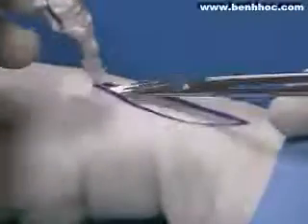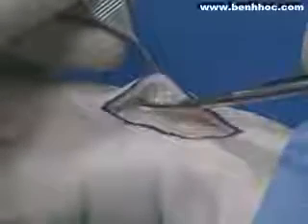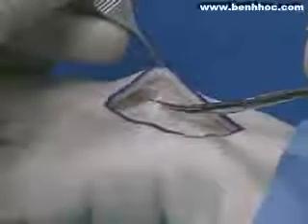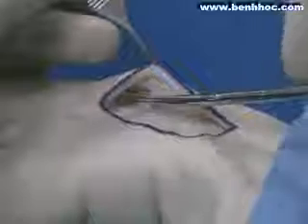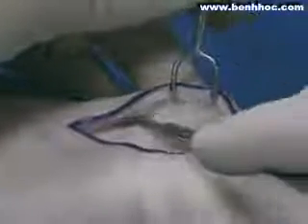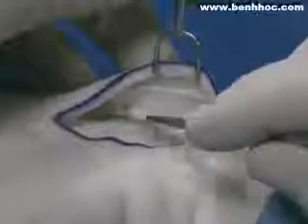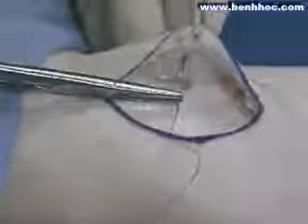The middle finger can also be used to aid in the retraction of the soft tissue during the dissection. In order to allow the tissues to come together during the closure, undermining is necessary. When scissor dissection is used, the tips of the scissors are best kept tip upwards towards the skin edge so that the deep structures are not inadvertently cut. A number 15 blade can also be used to continue the undermining. This demonstrates that either a scissor or a number 15 blade can be used to undermine the soft tissues, which will allow closure without tension.